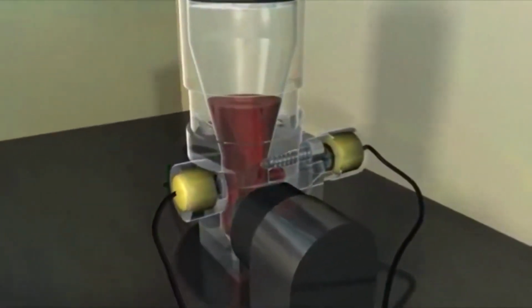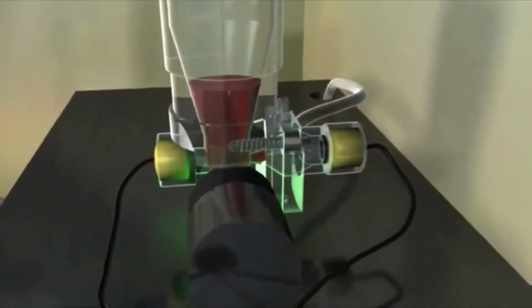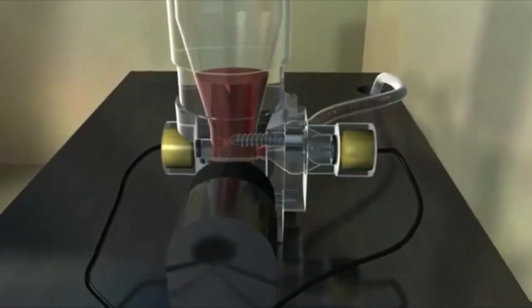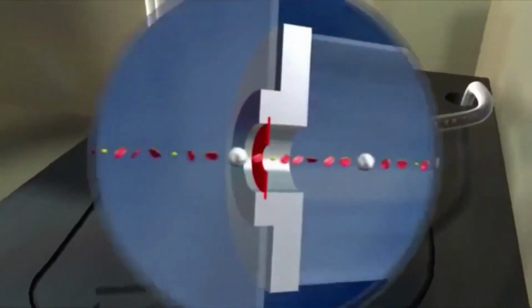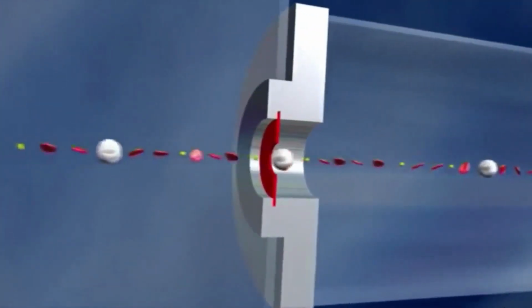Presently, over 98% of automated cell counters incorporate this technology, which is referred to as the Coulter principle. In the past 75 years, the technology has also been used to characterize thousands of different industrial particulate materials.